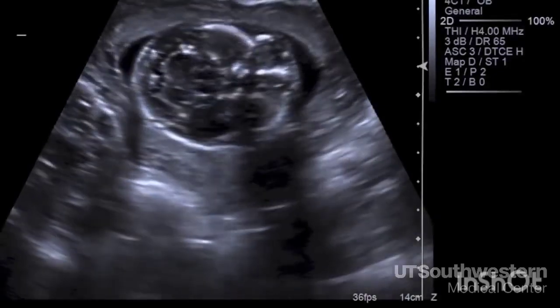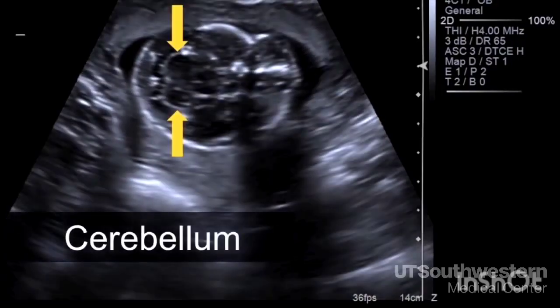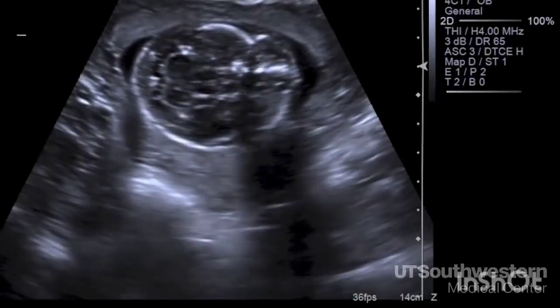We also look at this structure in the back of the brain, the cerebellum. It looks like 2 balls stacked on top of each other. For years, all we did was measure it for growth, but we now know the shape may be changed if the baby has a neural tube defect. So looking at this area helps us detect spina bifida.